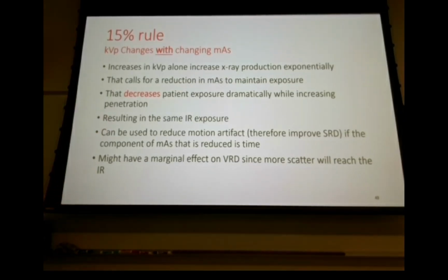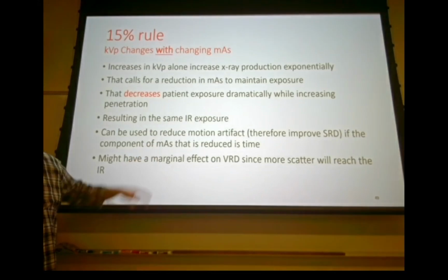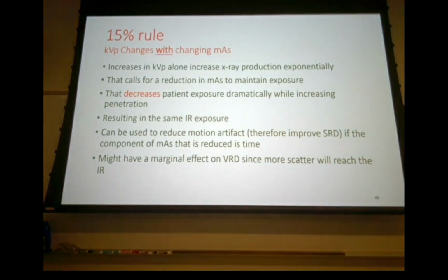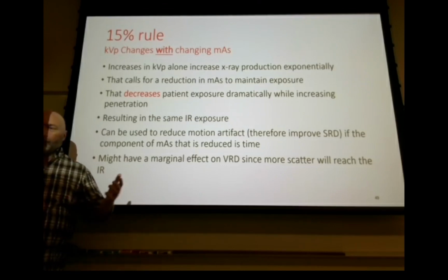That's number one. Number two is the 15% change is going to be asking you for changes at the image receptor. Okay, because with the 15% rule, you have no change at the image receptor. With the 15% change, you need to affect a change in your index number. This theoretically should not change your index number much, if it changes it at all. Okay, and you can play with these things too. Bring your rib bones.